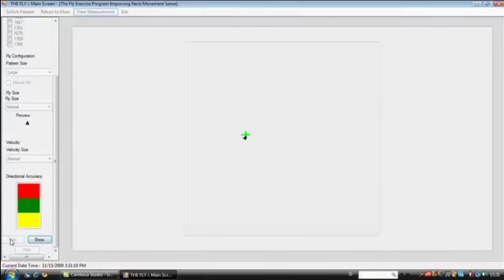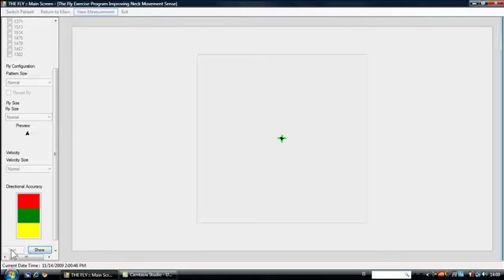Feedback during and after an exercise trial is an essential part of the fly exercise program. The following feedback is given. 1. Results of performance. The patient is given constant feedback while performing the exercise trial. The cursor changes color according to how close or far the cursor is in relation to the fly. When the fly and the cursor are in close approximation, the cursor is green. When the cursor is behind or ahead of the fly, the cursor is yellow or red respectively. This feedback indicates the directional accuracy of the cervical spine movements.